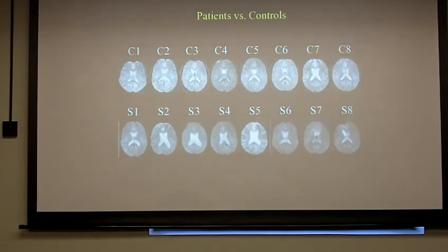Okay, so I'm here to ask the stupid question. So here it comes. Brace yourself. So here's what I don't understand, Hoon. You're studying patients who have all this atrophy, and so they have these big ventricles as a consequence of the atrophy. Somehow the warp is supposed, if it works right, to make them come out with brains with little skinny ventricles, right? What happens?